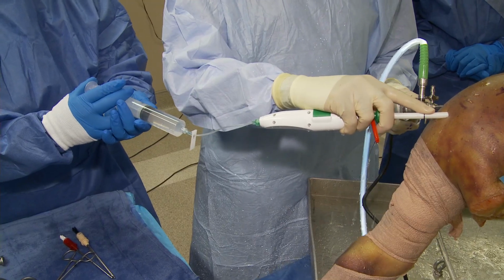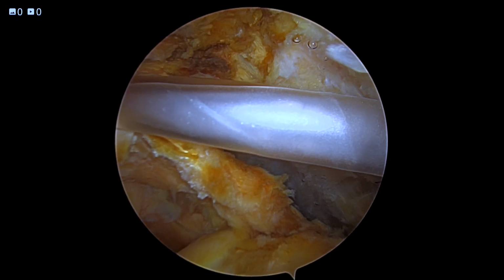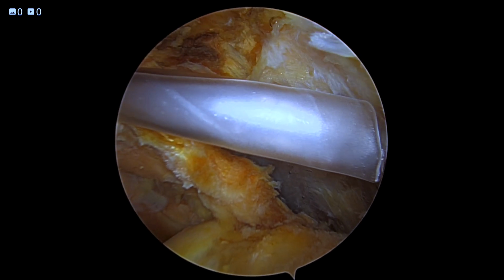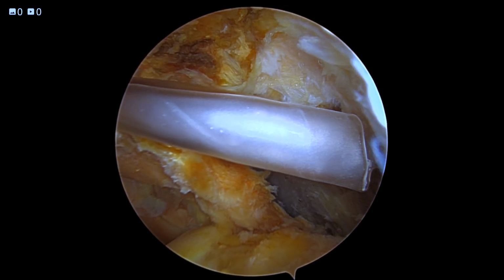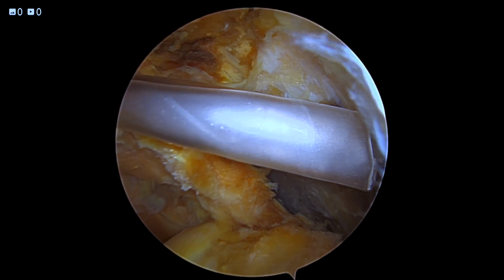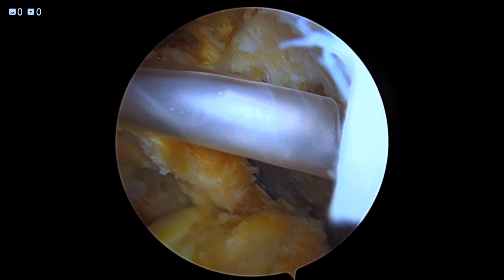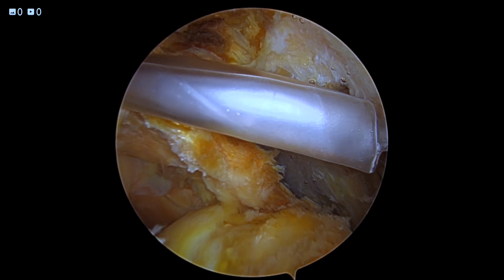So at this point, once you have the device exposed within the subacromial space, you really are committed, and there should be no manipulation of the implant itself, or you could risk perforation of the balloon. If you had a problem at this stage, it would be best to remove the entire implant and start over with a new deployer and implant itself. Here you can see the balloon is now in the subacromial space. We've removed the sheath to expose the balloon.